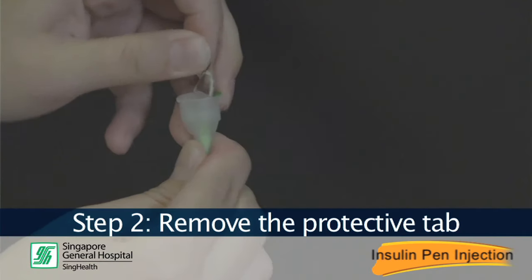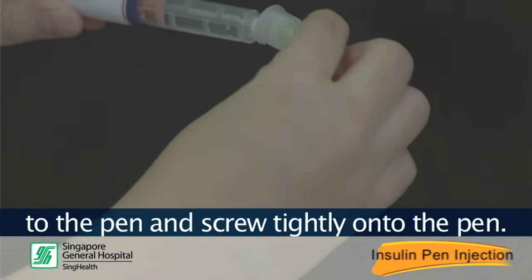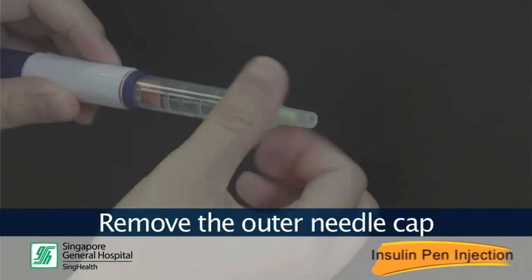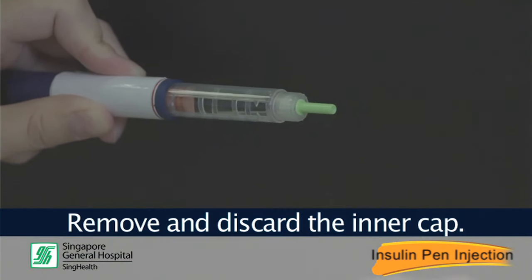Step 2. Remove the protective tape from the needle, then attach the needle to the pen and screw it tightly onto the pen. Remove the outer needle cap and put it aside. Remove and discard the inner cap.